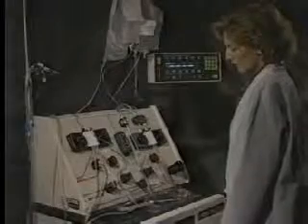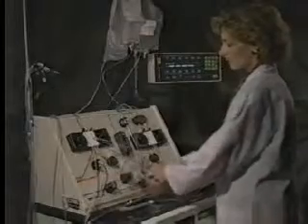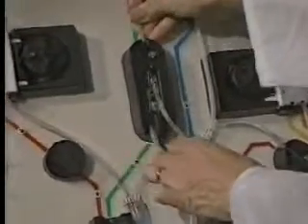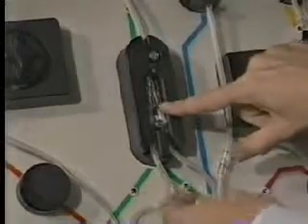Note the 2 air detectors and the waste valve assembly. Insert the waste divert lines into the waste valve assembly above the air detectors. Then pull down on the inlet and return waste lines until the Y connector touches the pin.